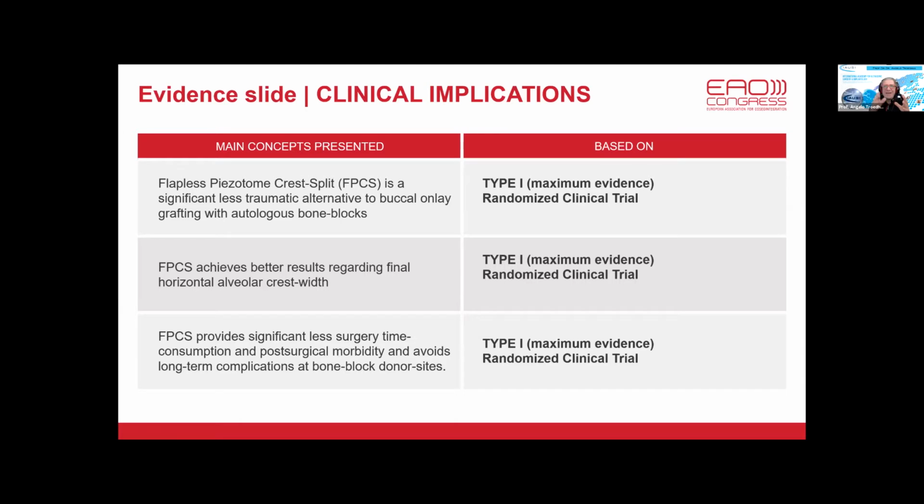And once again, please don't hope that an autologous bone block disconnected from blood vessels at the transplantation does have any biological activity, because this is known since 1960 of the last century, which was investigated by orthopedic surgeons, which are tackling with the same problems. Everything is dead in this bone. There is no biological activity. And of course, once again, Flapless Piezotome Crest Split provides significant less surgery time consumption and post-surgical morbidity.